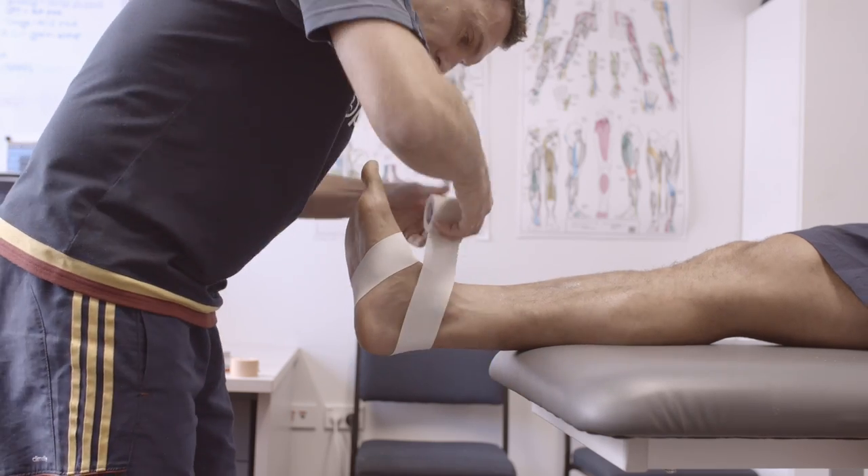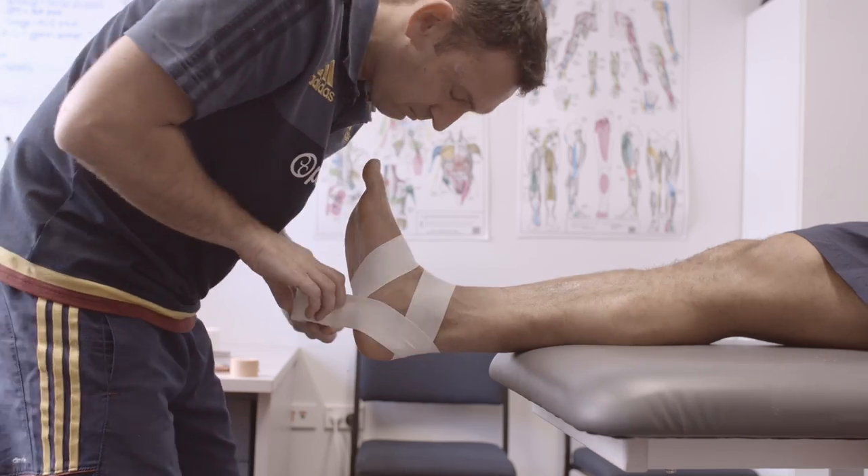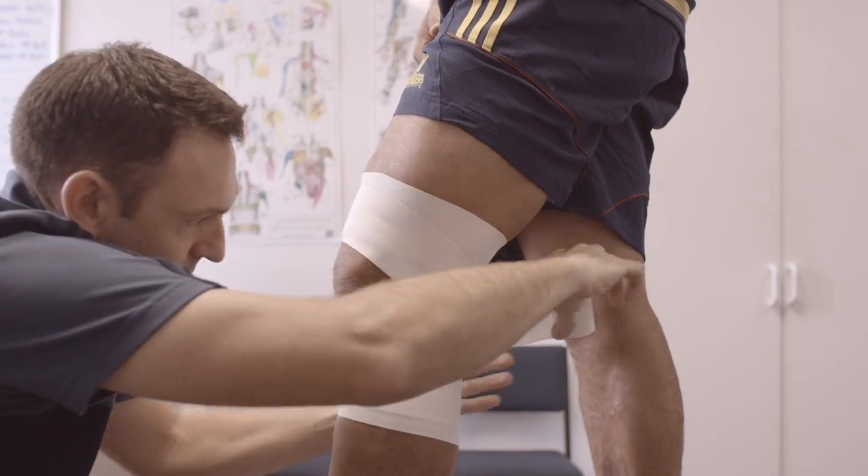Yeah sure, EAB tape is a versatile sports tape that allows stretch lengthways. The good thing about EAB tape is it replicates a ligament, so it allows for good compression and flexibility around an injured joint.